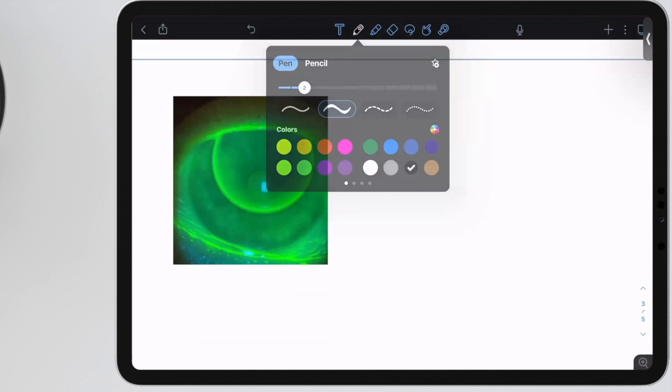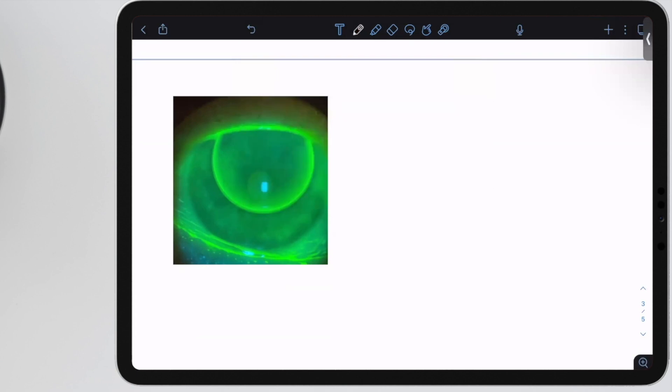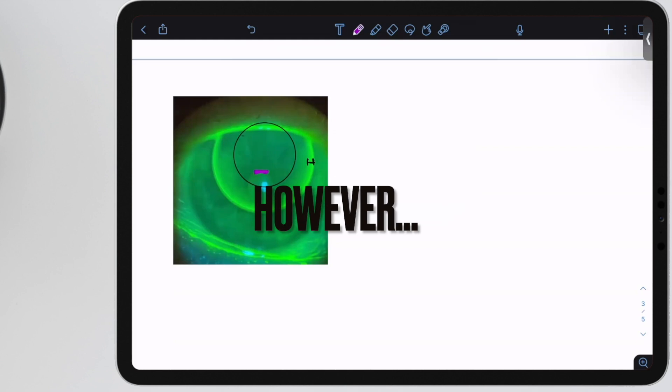What are you seeing with this fluorescein pattern? I hope you're yelling at me that this looks perfect, because it does. Look at that beautiful, even pattern of fluorescein underneath this lens. You'll see that until you get out to those peripheral curves, everything is even. It's shallow enough that you can see the iris and pupil details through it.